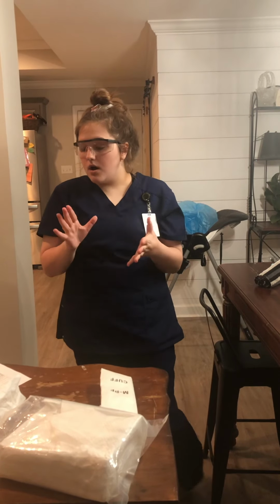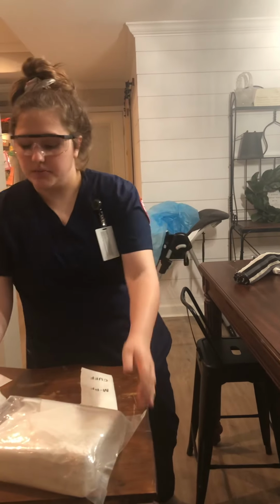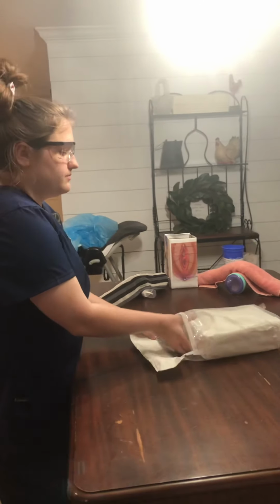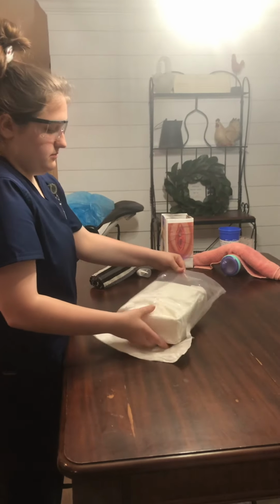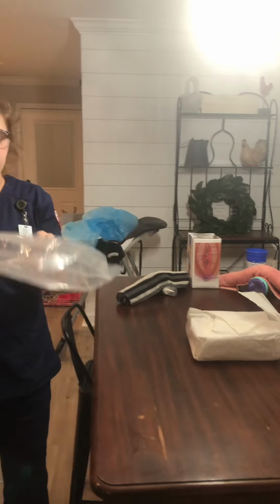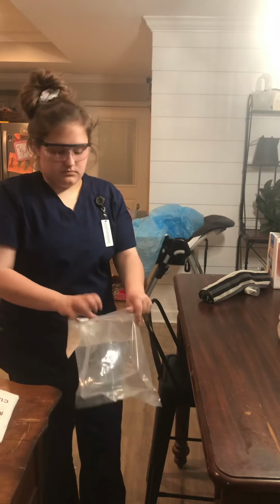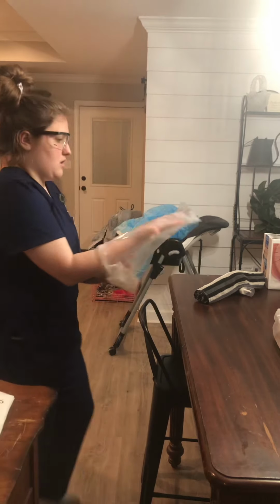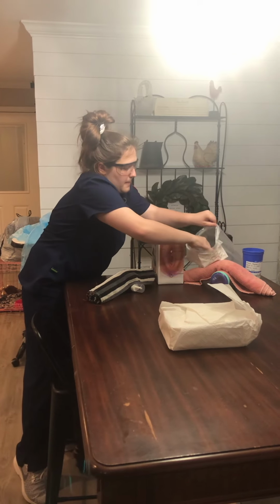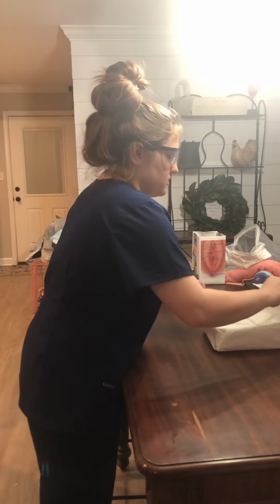And now I'm going to provide my care. So I'm going to take my kit over here and open it up. I'm going to take it out, and I'm going to create a trash bag with this, and I would put it next to my patient's hip.